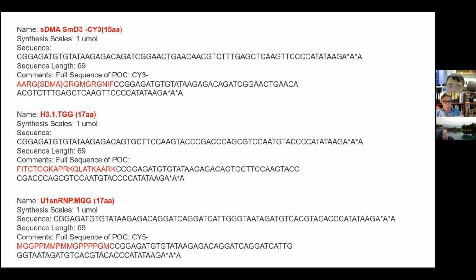You mean a double staining? Yeah, we know what these antigens are. If we got antibodies like anti-SM that bind to this, whatever he used, anti-SM would bind to that and anti-SM binds to this.